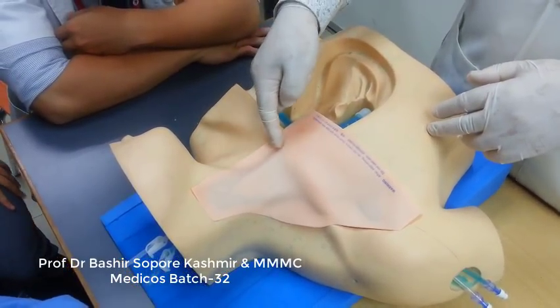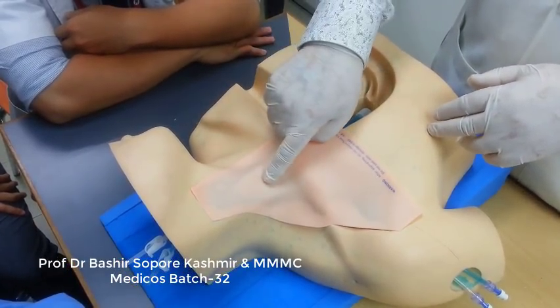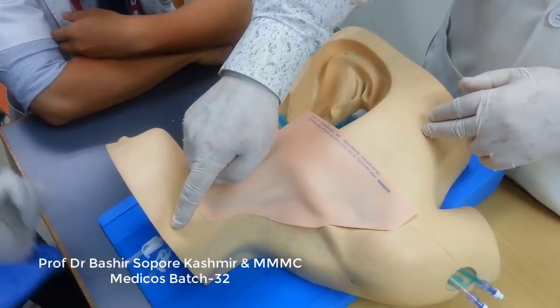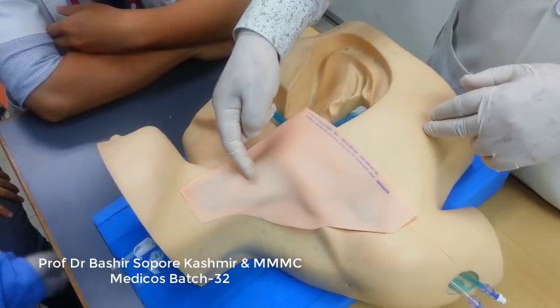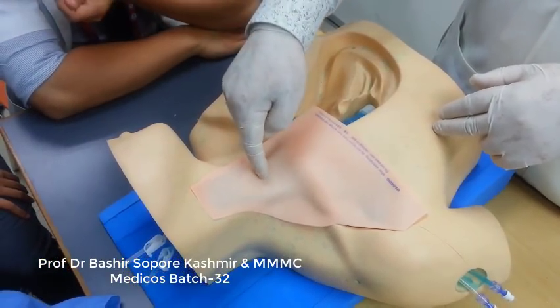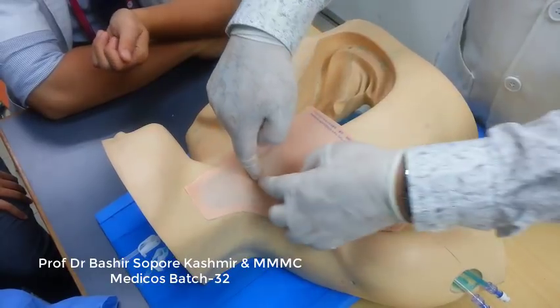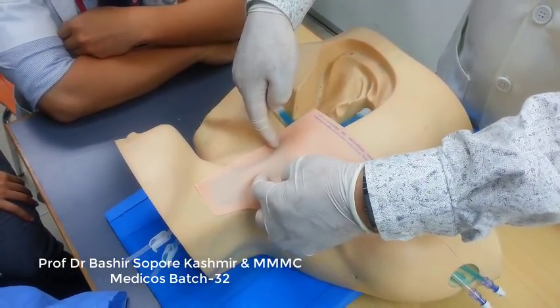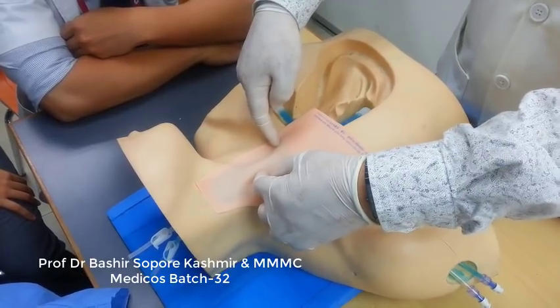The posterior approach is from the point from clavicle to mastoid process, at the 1/3 of this line you insert the needle. The needle direction should be towards the sternal notch, 45 degrees. This is called the posterior approach.